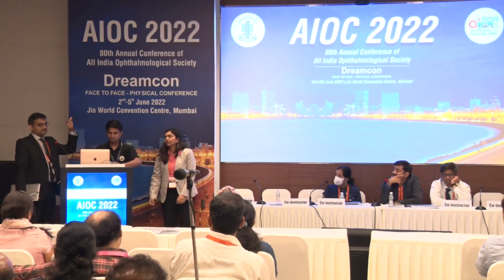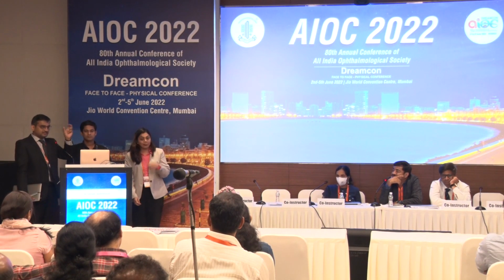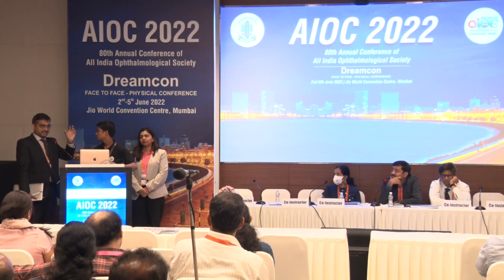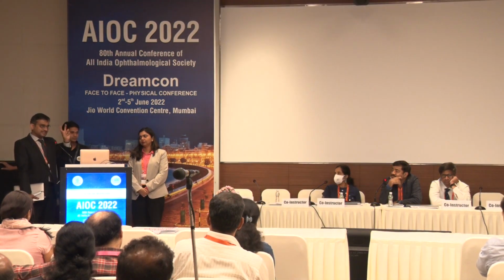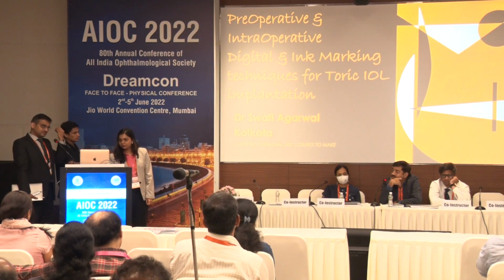I think the slit lamp examination, rule out any corneal scars. Autoref and manual K should match preferably, and the difference between the axes should not go beyond 10 degrees, because a 10 degree error in the placement of the IOL will reduce your effectivity by one third of the corneal cylinder. So a 10 degree mismatch is fine, but beyond 10 degrees you should do a topography. Topography is easily available. Most of the biometers now have topography. It is a very good idea to do a topography and see the map, because most of your problems will get solved in the map.